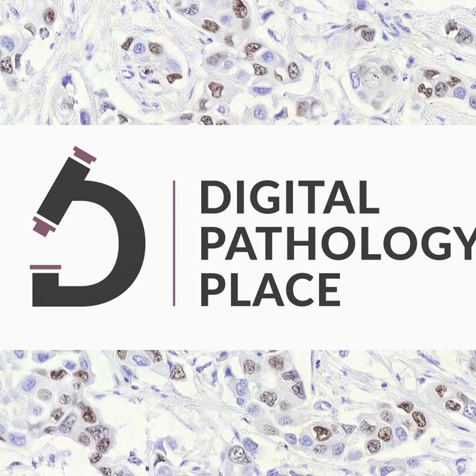And as everybody in computational pathology knows, for a slide, that's not so easy. A typical slide consists of more than 10 billion pixels. Just to put it in context with common computer vision data sets, one single slide is already 1/10 of the ImageNet challenge, and the ImageNet challenge is 1 million images. I love this comparison.